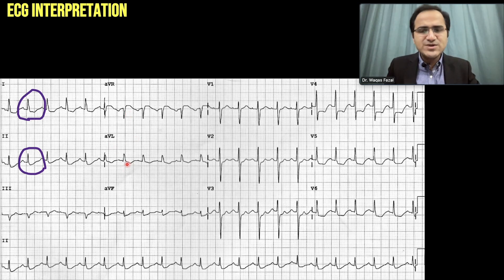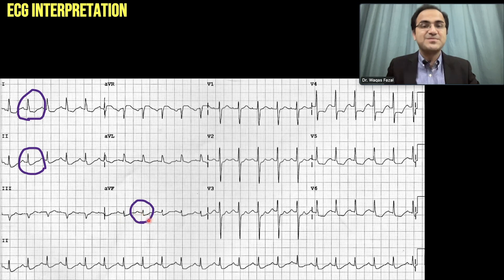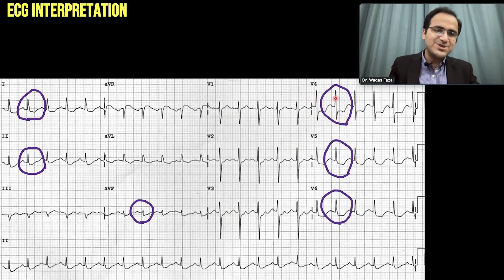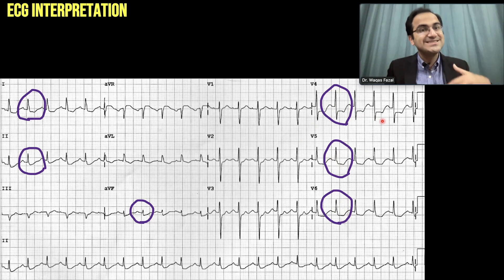AVL is showing somewhat depression but not very prominent. AVF is showing ST segment depression — compare the P wave, PR segment, and ST segment. V1, V2, V3 show no ST segment depression. V4, V5, and V6 show prominent ST segment depression. So this ECG indicates subendocardial ischemia with ST segment depression.